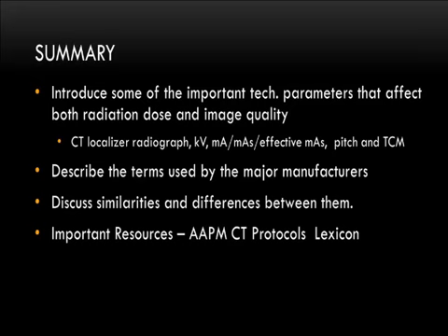So since nobody's jumping up to the mics, I'm going to ask a question. I'm pretty sure I heard somebody from Siemens say once that the standard size patient that the quality reference mAs is based off of is the standard man who is 5'8", male, 20 to 30 years old, and weighs about 150 pounds. This guy never goes into my CT rooms. Is that the correct interpretation of what the quality reference mAs is supposed to size to? Yes. Okay. So just making sure everybody's aware of that.